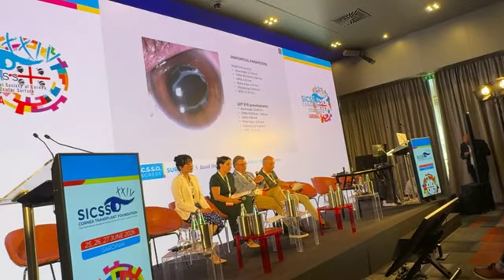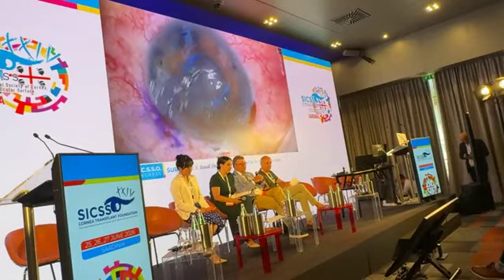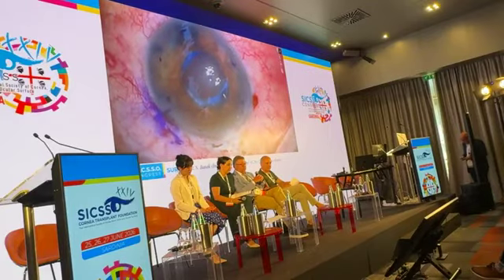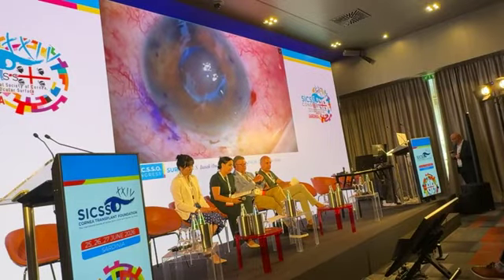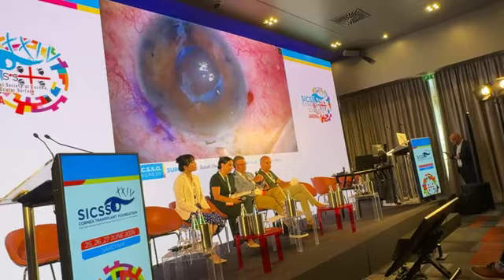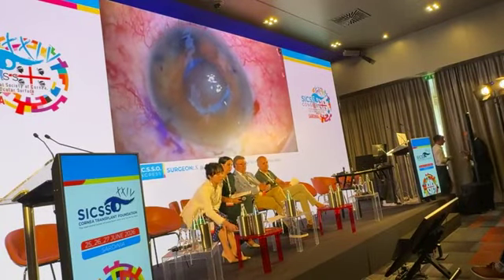We also measured the parameters of the pupil before and after dilation before surgery, but we will get back to this maybe later in a bit more detail, so that now we can go directly to the surgery. As you can see, he has already performed the Descemetorhexis also. He has started from a superior approach. We have already arrived at the stage of the Descemetorhexis.